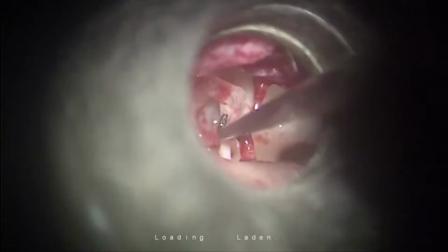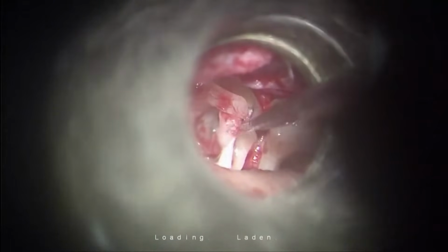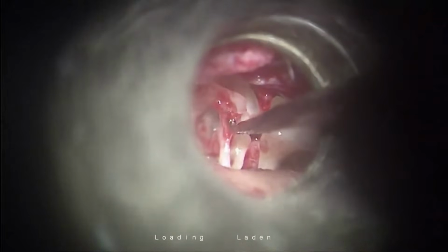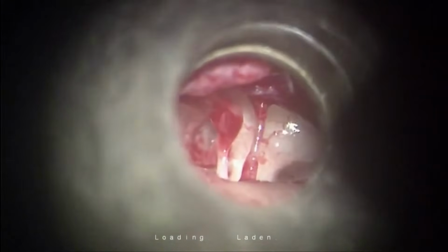So how to ascertain the joint? You mobilize in the anterior-posterior plane the long process of the incus and get into the joint directly. That's a very, very important step without traumatizing the lenticular process. And I can see, make this incudostapedial joint absolutely free.